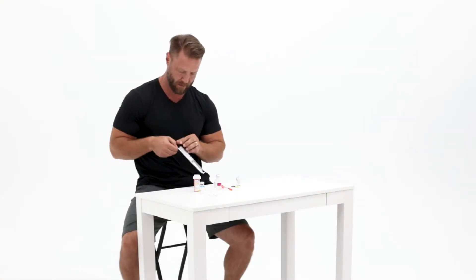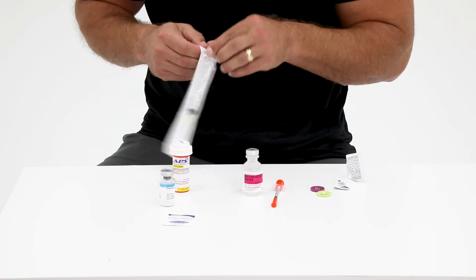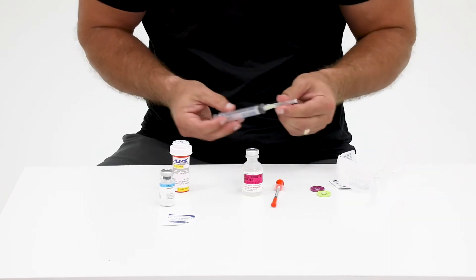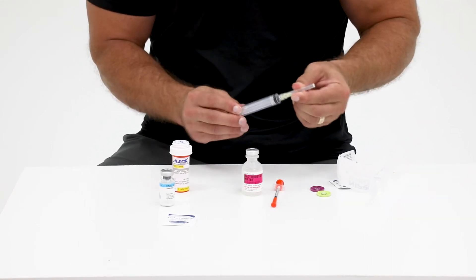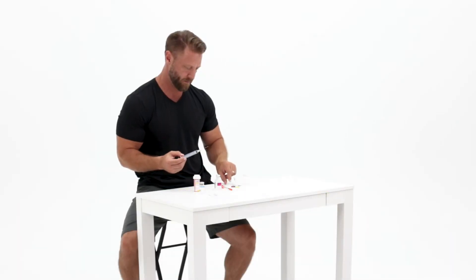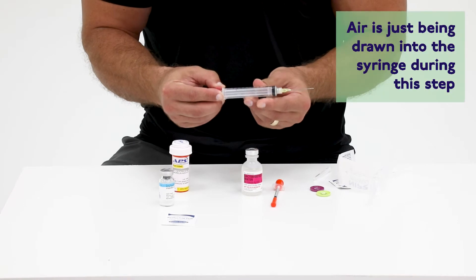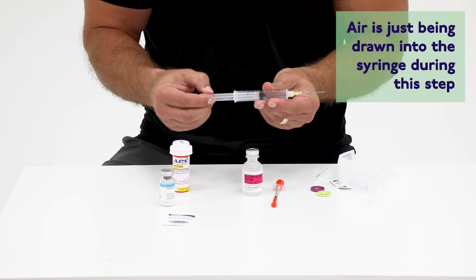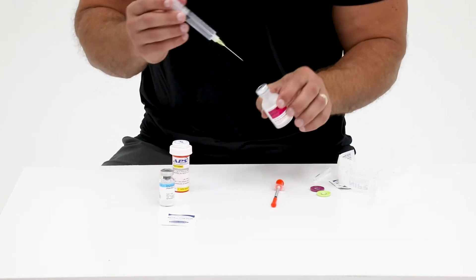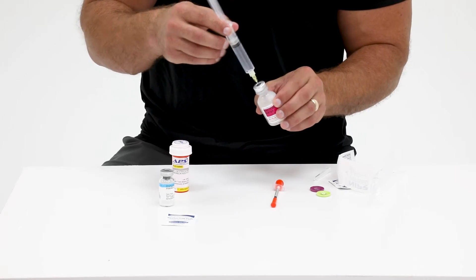Now take the large 10 milliliter syringe with needle out of its wrapping. Make sure the needle is on tight by pressing and twisting the cap of the syringe. Pull back the plunger to the black line which your healthcare provider has prescribed. Hold the barrel of the syringe as you insert the needle through the rubber stopper of the water vial.